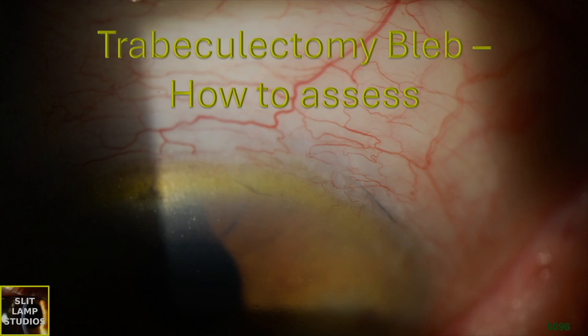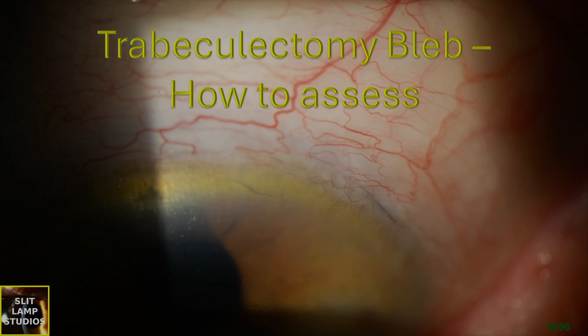Trabeculectomy bleb: how to assess. Here's a video of a patient who has had a previous trabeculectomy, and I'm going to be talking to you about how to assess that bleb.